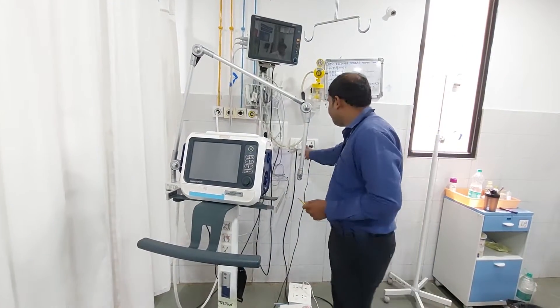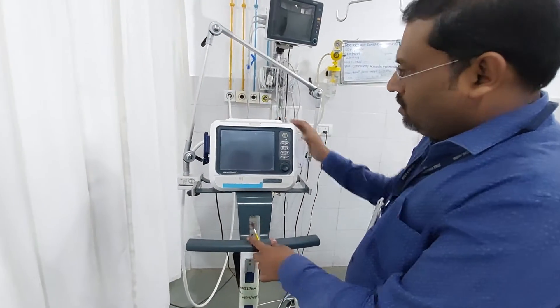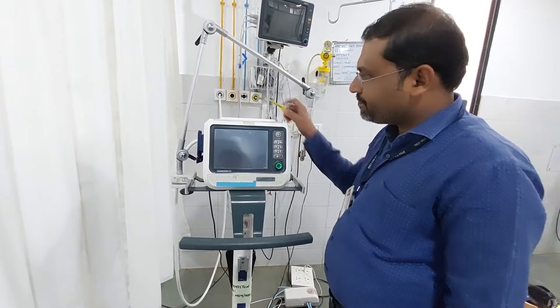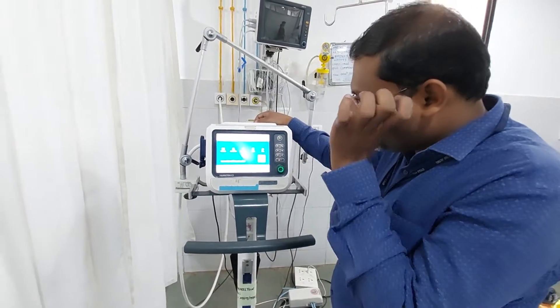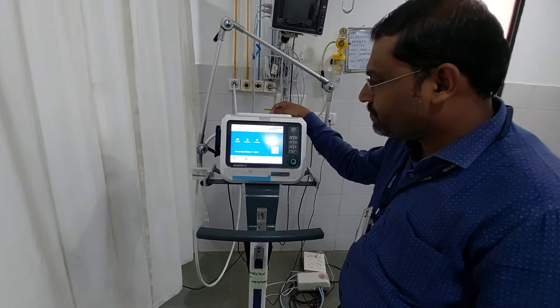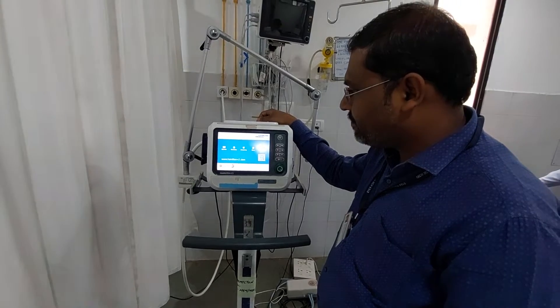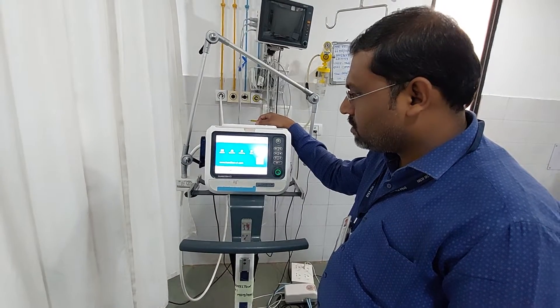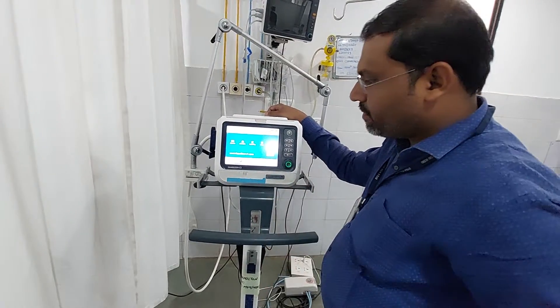Let's switch on the machine. The machine will take some time to boot up — wait for some time. The self-test is under process. After completion of the self-test we will proceed.